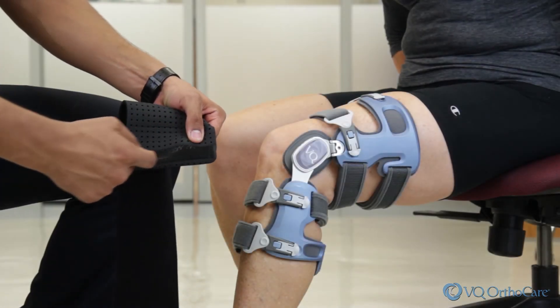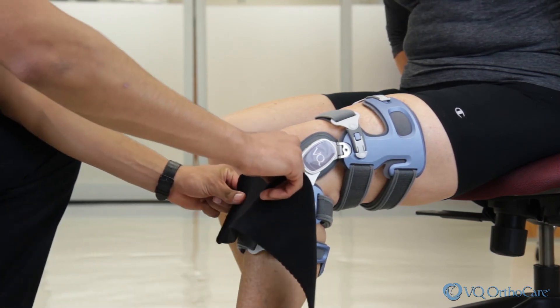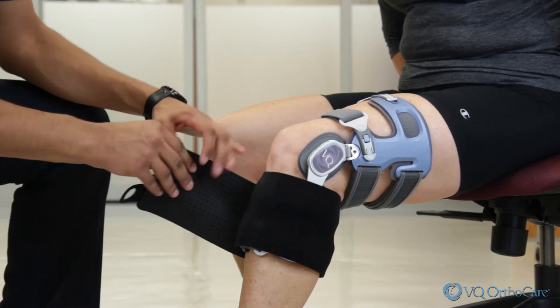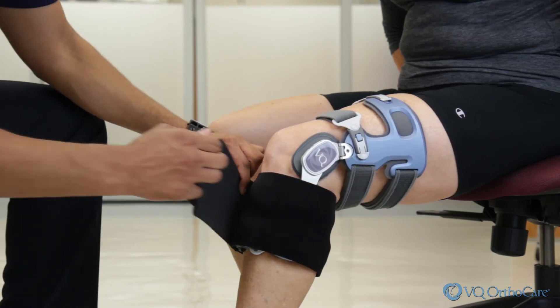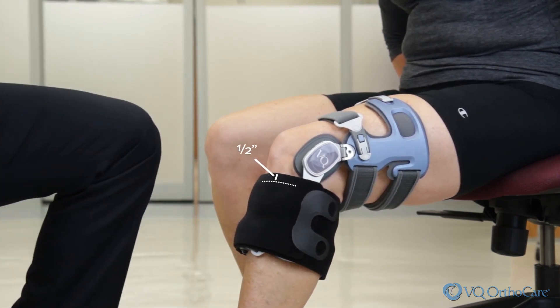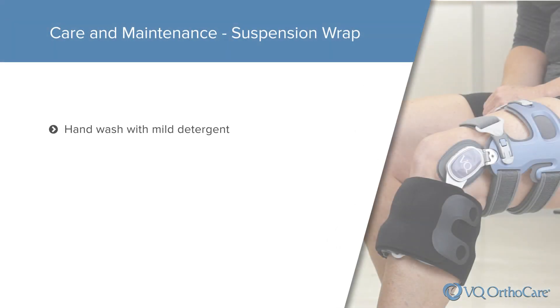Attach the velcroed straight edge of the suspension wrap to the inside two straps of the lower half of the brace. Pull the wrap around the outside of the leg and continue to wrap, attaching it to itself by pressing down the finger pulls at the end. The wrap should be positioned so that the top edge is a half inch above the strap right below the knee, but it should not bunch in the back of the knee. The wrap should be removed and hand washed as needed using cold water and mild detergent. Rinse thoroughly and air dry; do not machine dry.